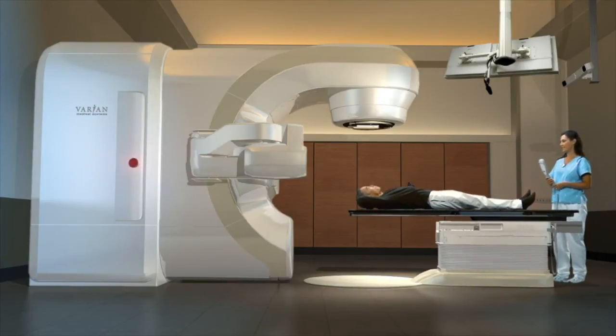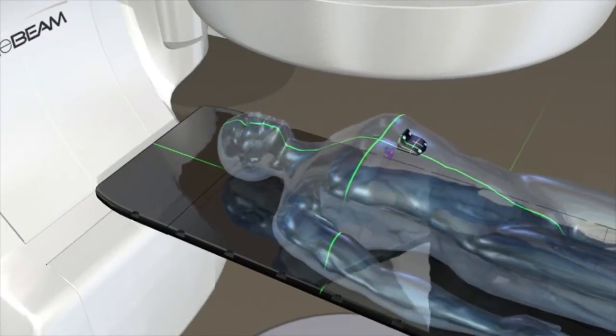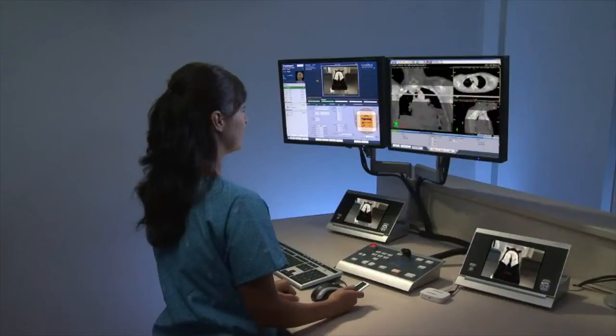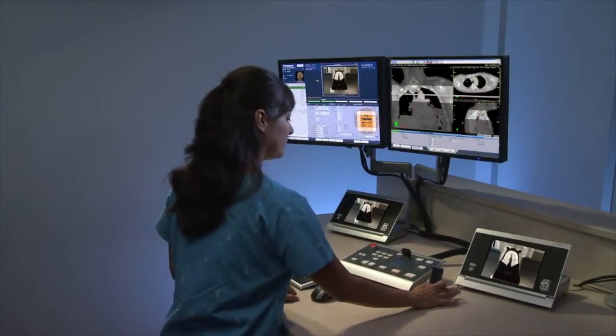Next, the therapist precisely positions you by aligning lasers to the marks on your skin. The radiotherapist will complete the rest of your session from outside the treatment room. If you like, soft music can be played.